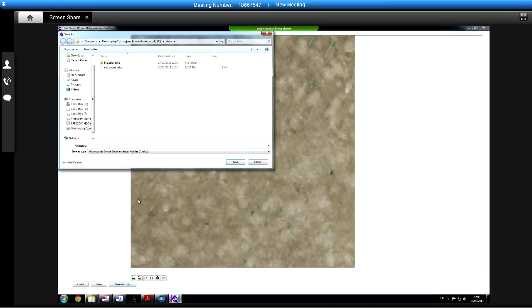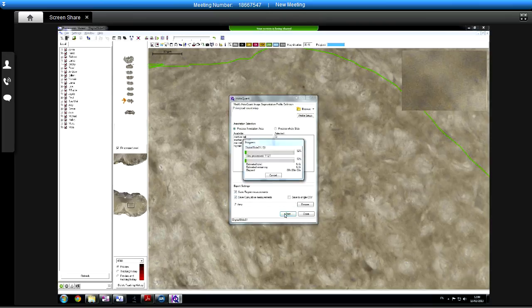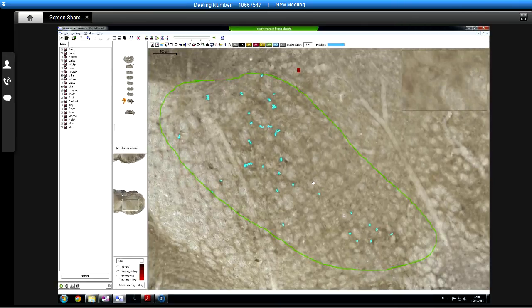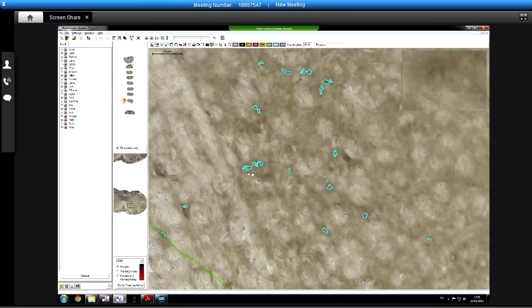So now let's just run that on that GI area again and see what we get this time. So let's just show measurement annotations now. I think that looks more realistic to me. There seems to be less rubbish there now, doesn't there? In some ways, it doesn't look so pretty because we're sort of randomly marking it, but I think we're pulling out the true positives more, aren't we? Does that look more realistic now? Yeah. Okay, so let's say we were happy with that.